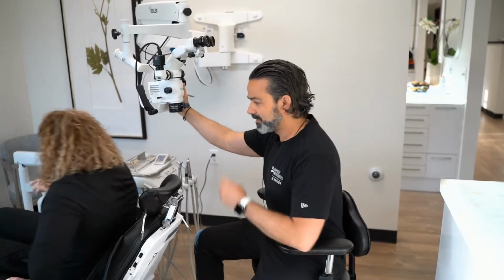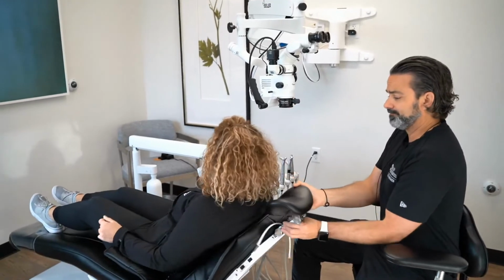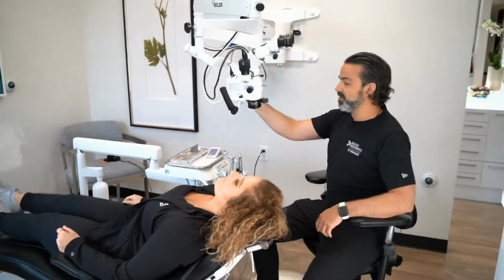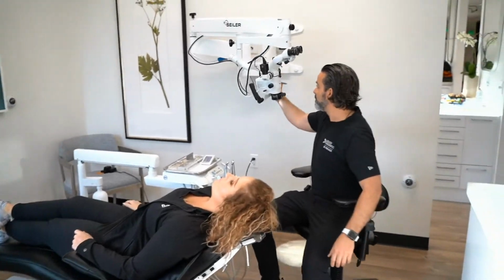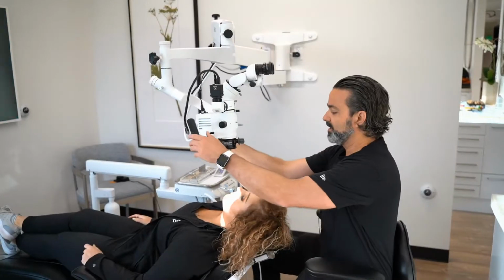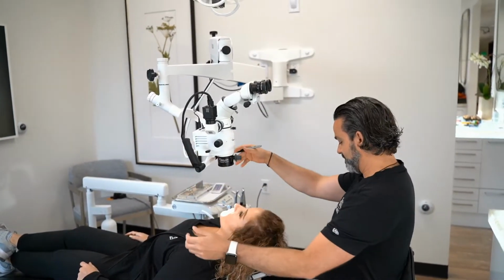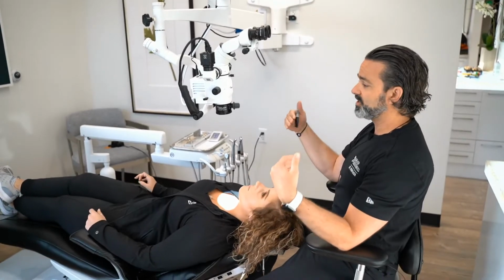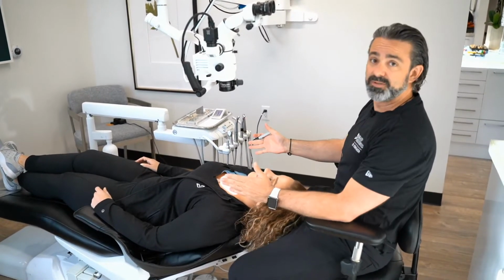Yep. So I can put my patient down. Rest your head back, please. And this way, I'm always in this motion. Like it's always, I'm sitting, it's very comfortable. I can bring it over. And the first thing that I'm going to do is position my patient, but I'm going to position my patient in my lap.